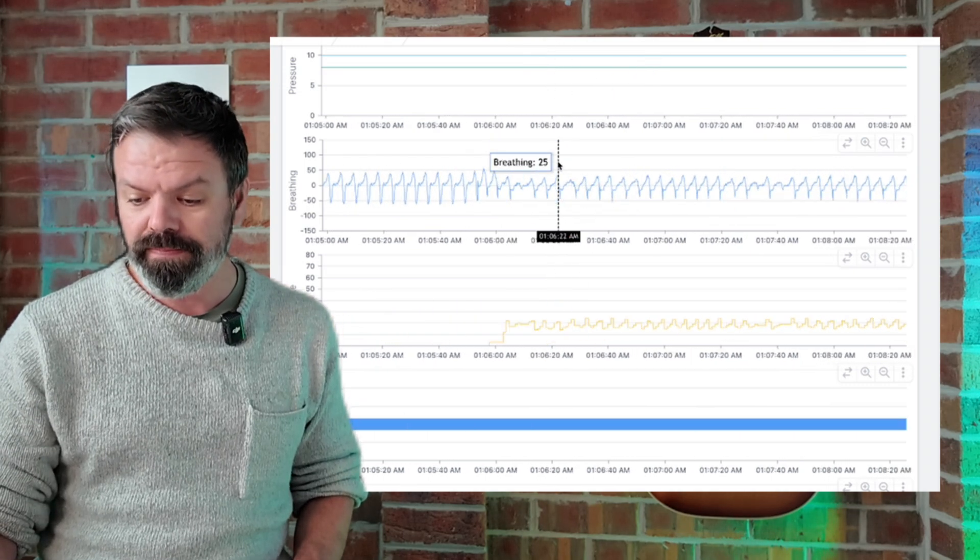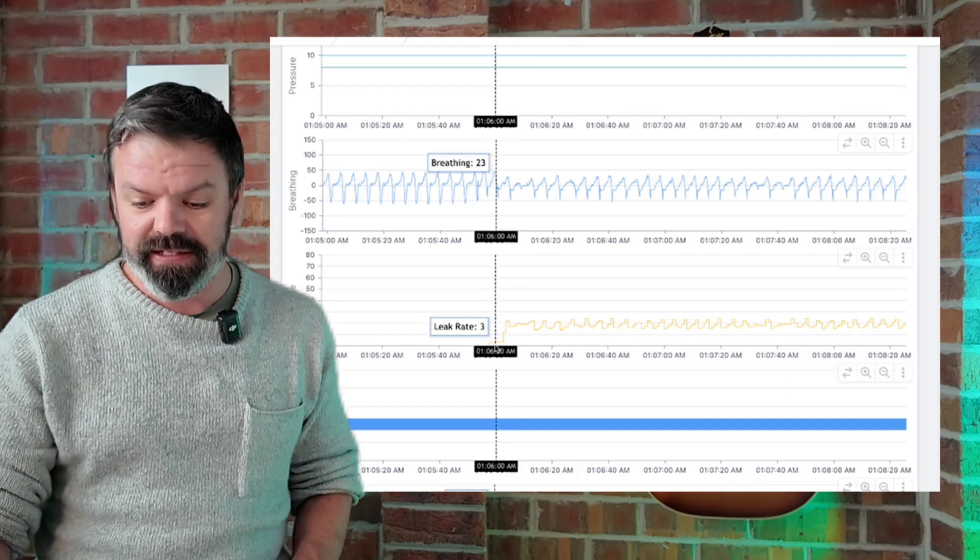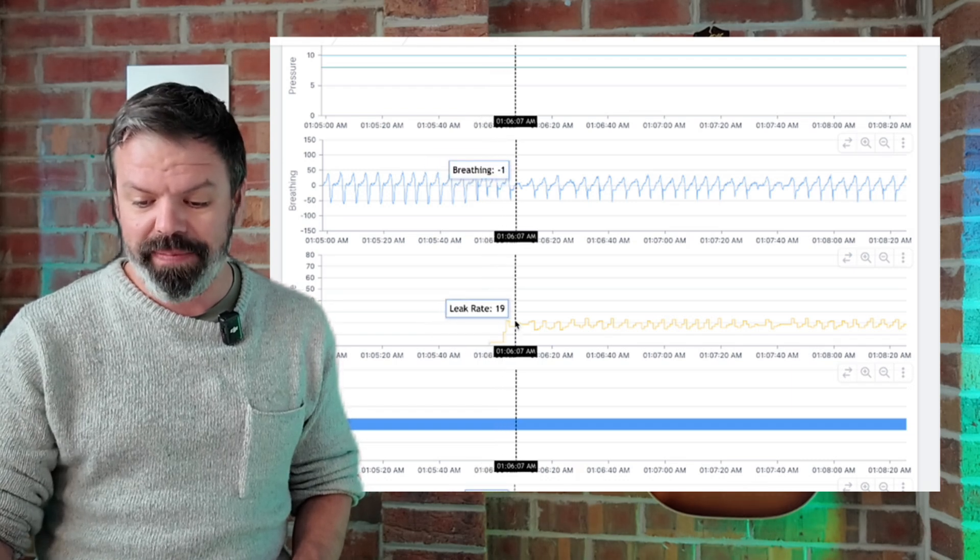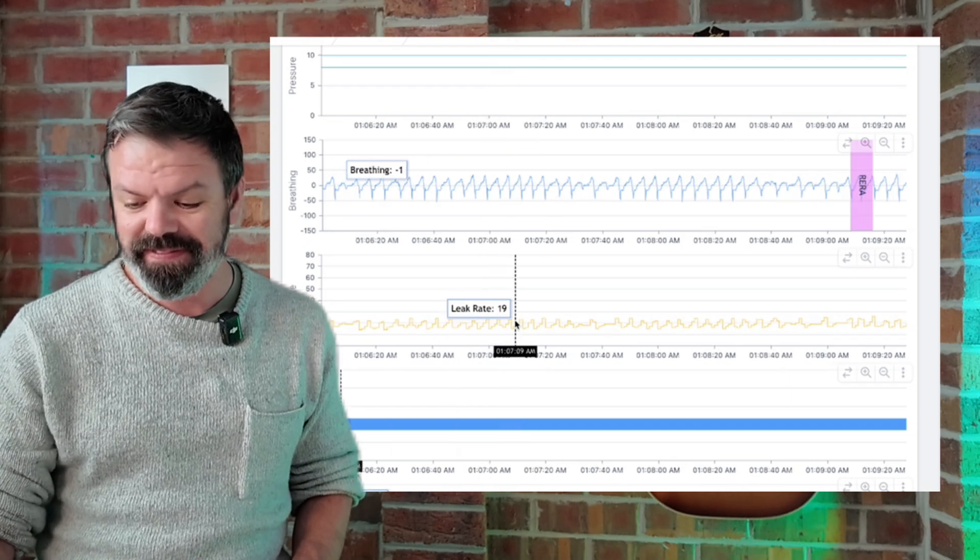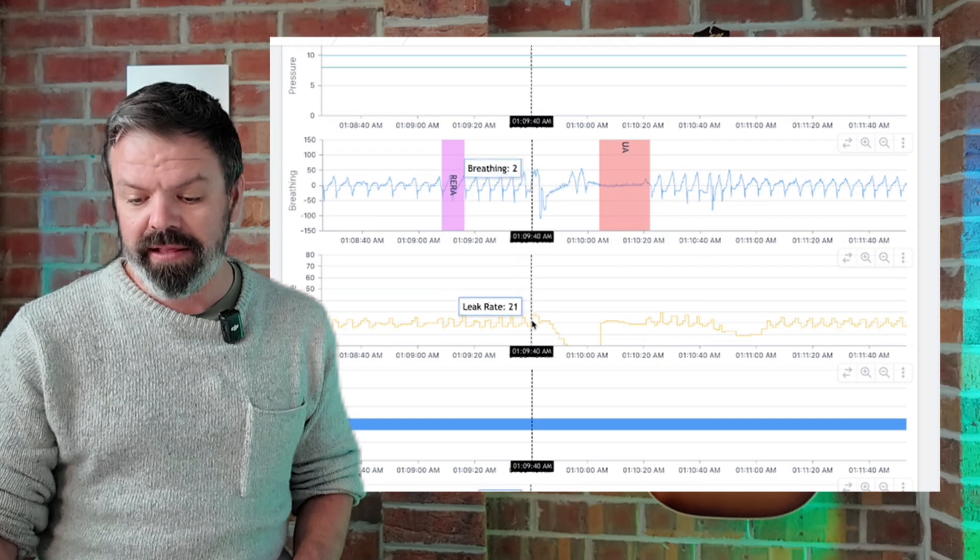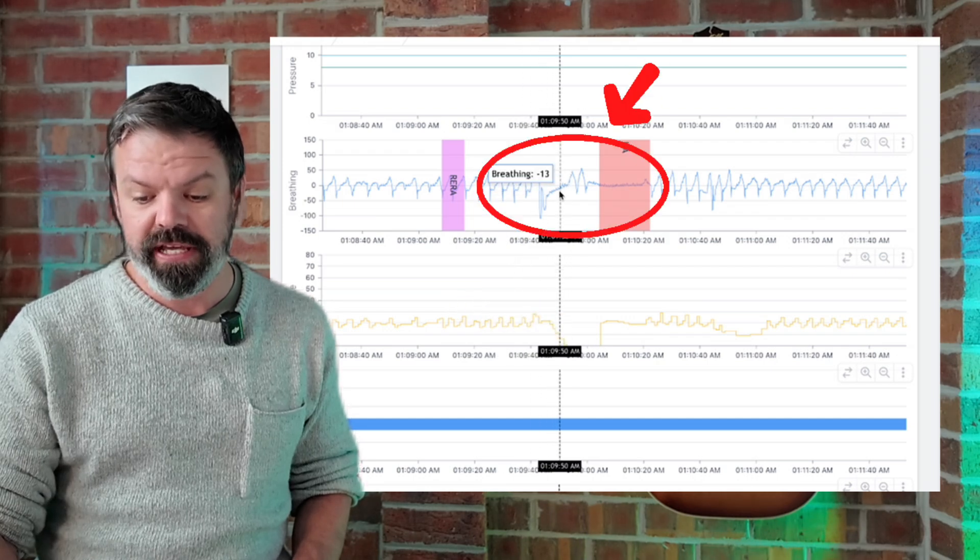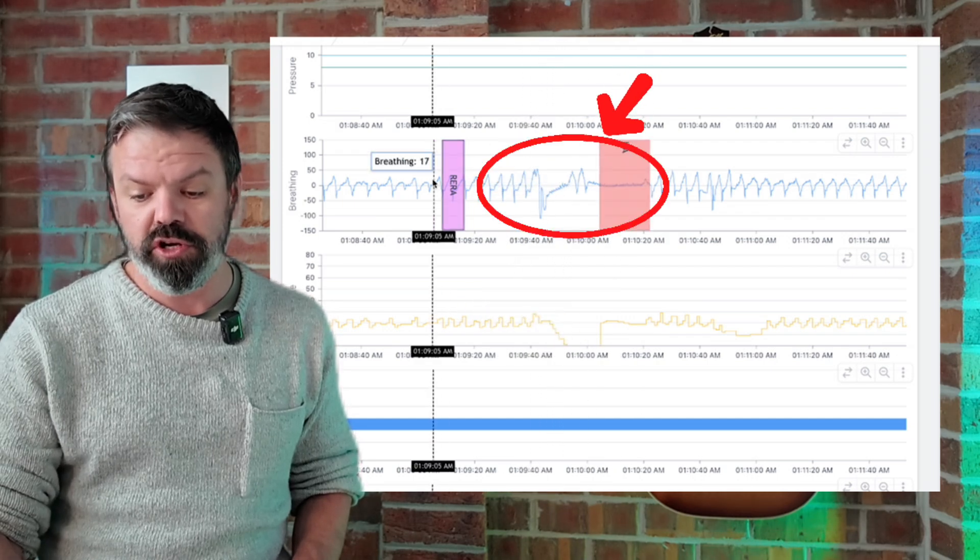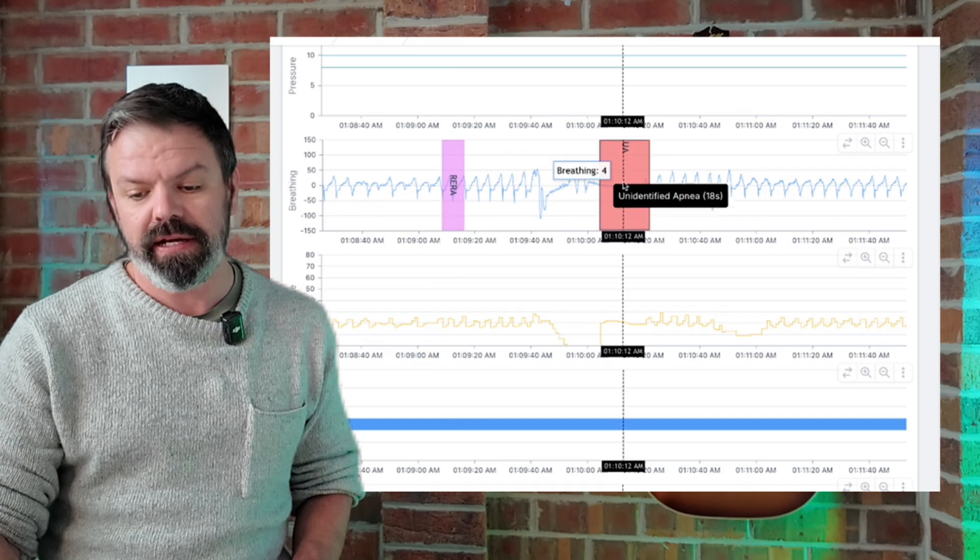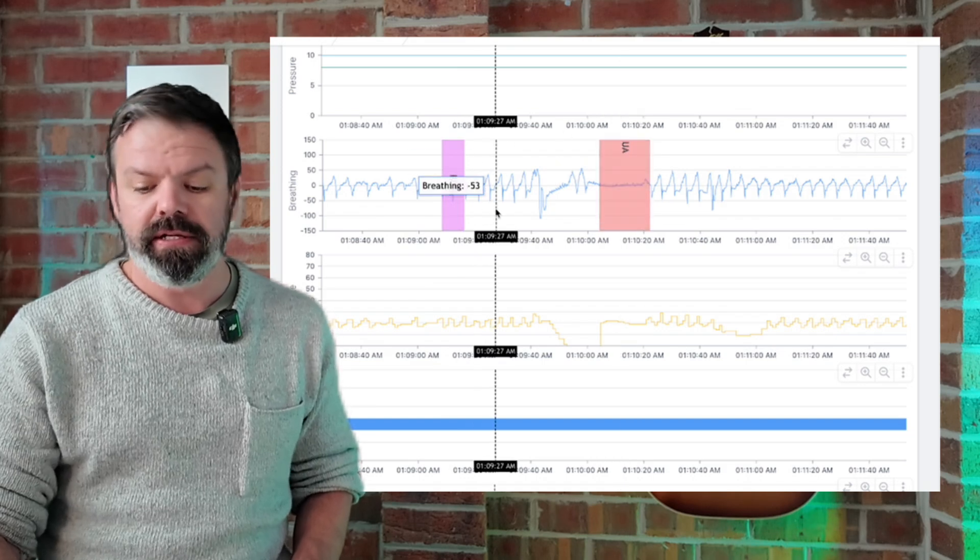We'll just scroll forward a bit more. So mouth leak starts up here. Mouth leak, mouth leak, mouth leak. Mouth closes here. Disturbance. Okay, it's waking him up out of sleep.